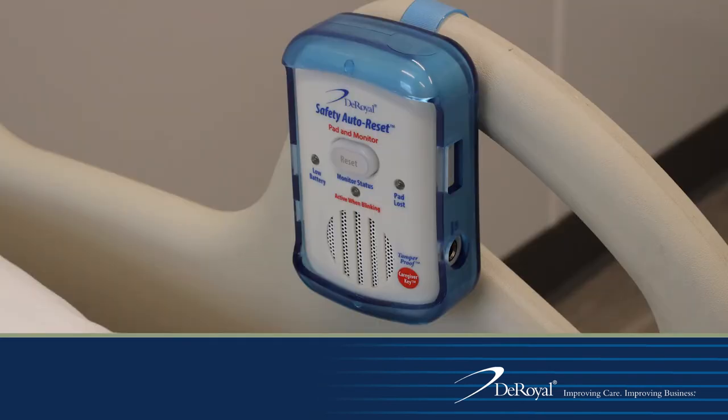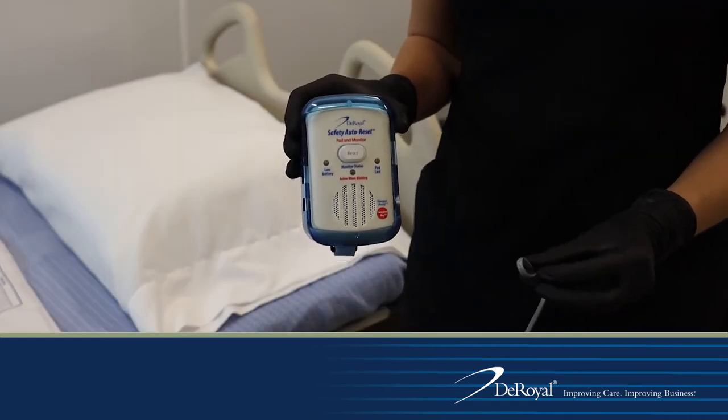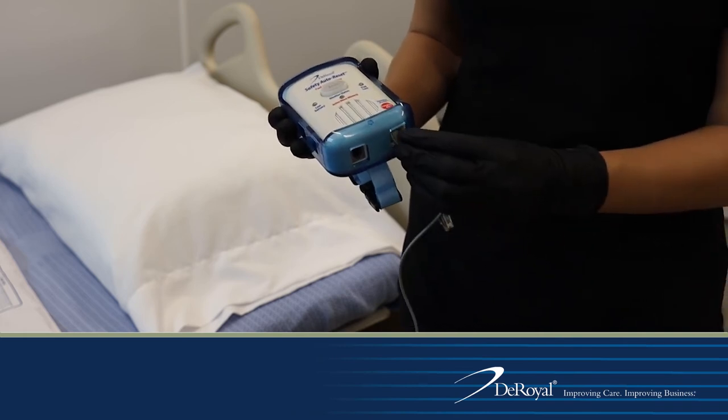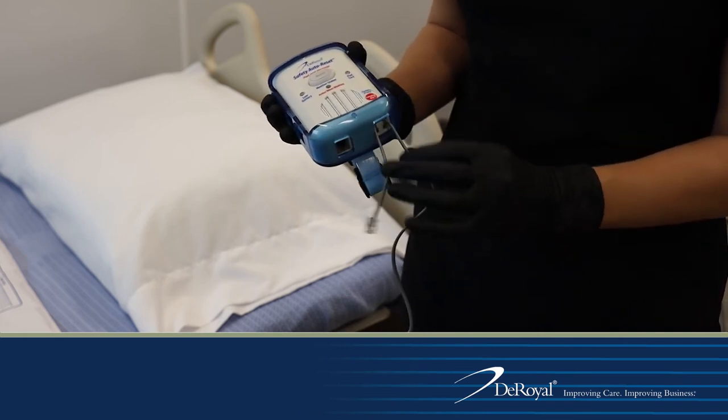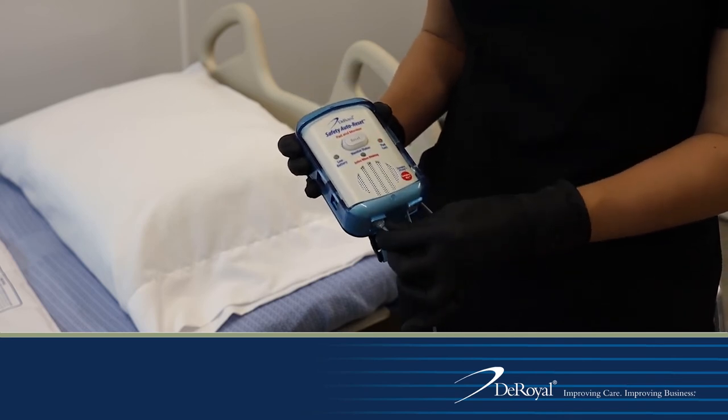The fall monitor can be mounted on the wall or on the head of the hospital bed. When connecting the sensor pad cord to the monitor, pinch the cord together and route it through the strain relief recess on the fall monitor. Insert the plug into the plug input located on the bottom of the monitor.